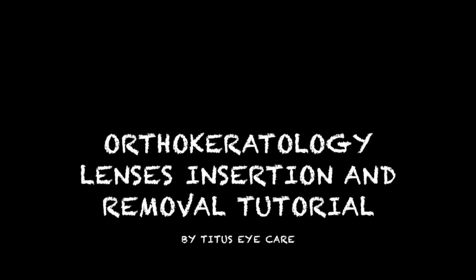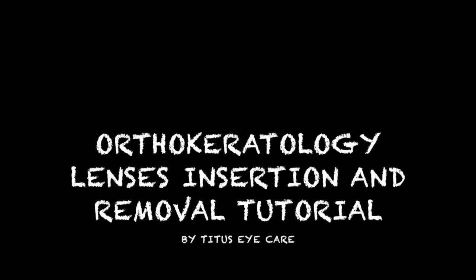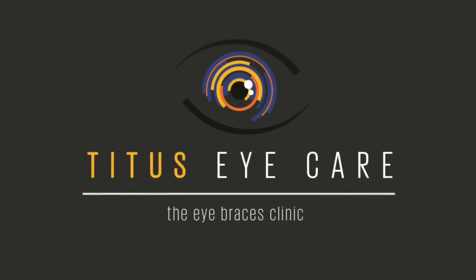This video is a tutorial on the insertion and removal of orthokeratology lenses, brought to you by Titus Eye Care, the Eye Braces Clinic.